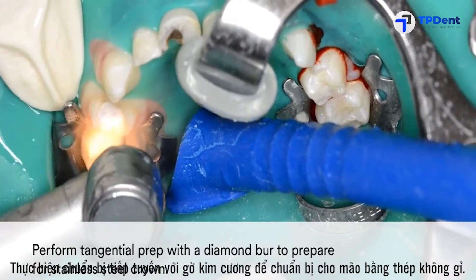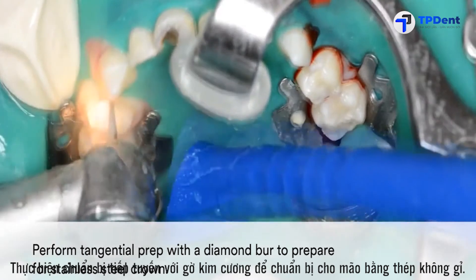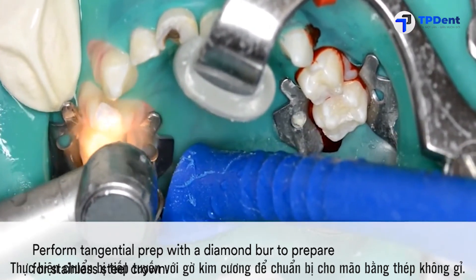After sealing the pulp, perform tangential prep with a diamond burr to prepare for the stainless steel crown.